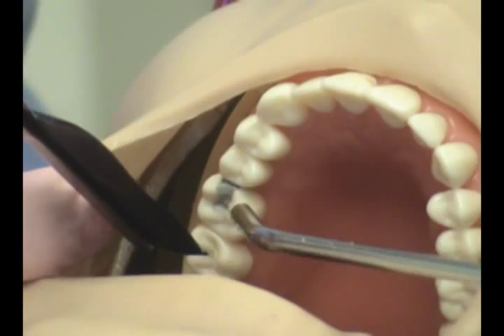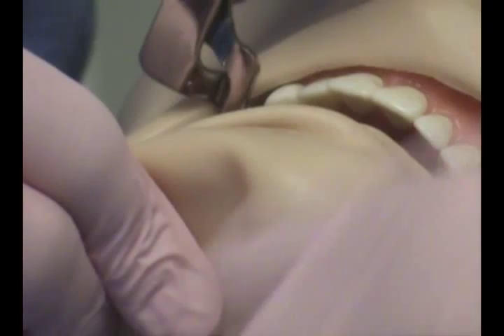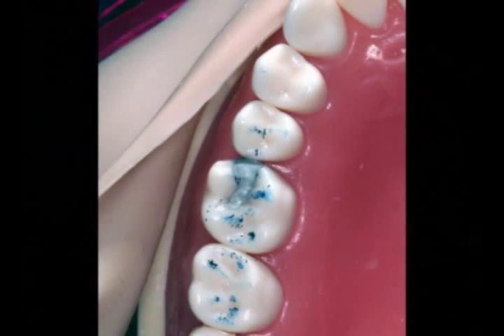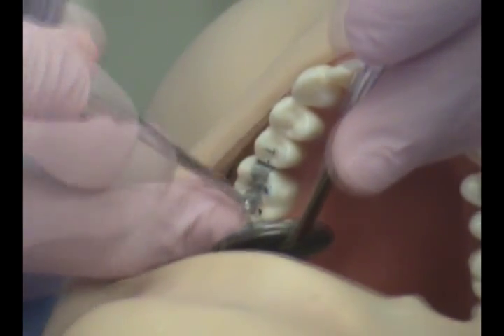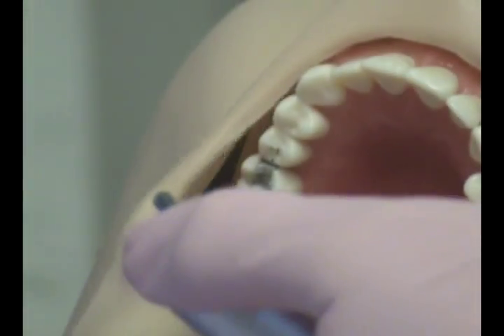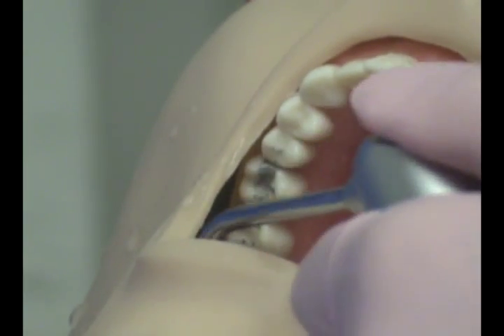The last thing we'll do is check the patient's occlusion using articulating paper. Since Dexter can't occlude on his own, we'll give him a little help. The occlusion is checked to make sure that the patient is not hitting the restoration excessively. Once the occlusion is checked and adjusted if needed, a final polishing will be done. The contact is now flossed to remove any amalgam particles that are still present. At the end of the procedure, a full mouth rinse is done to remove any loose particles that may still be present.